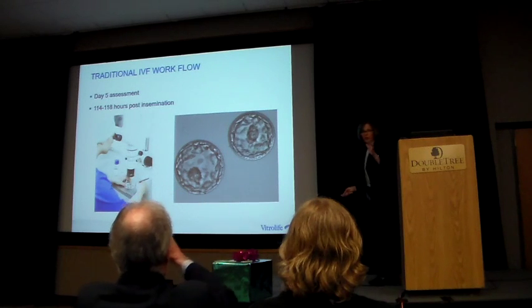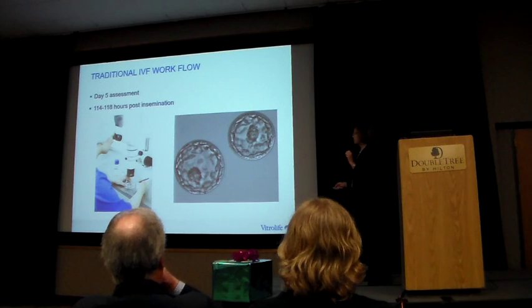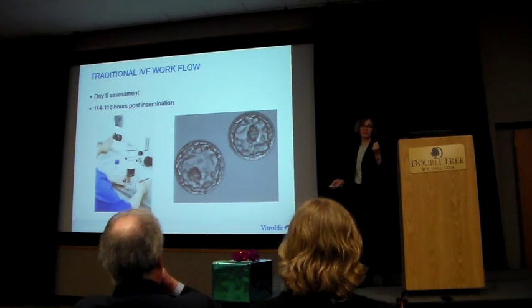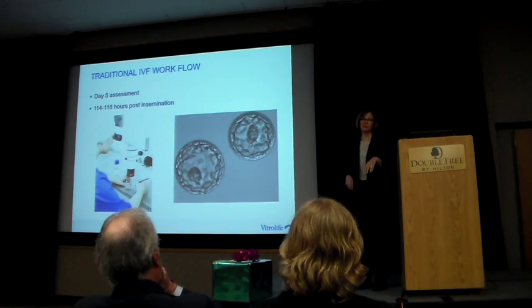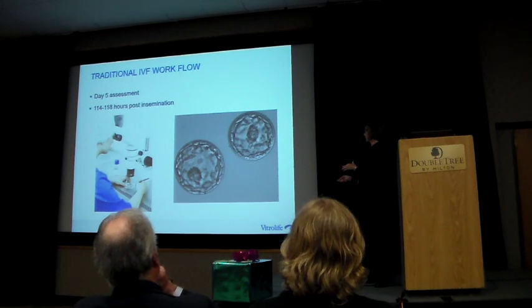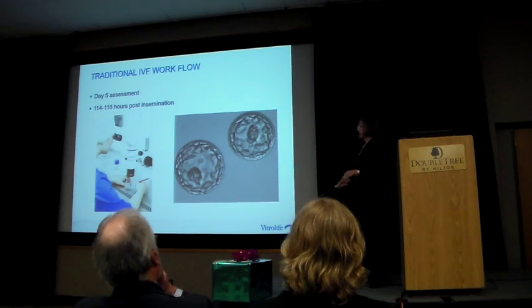It doesn't matter what they are, but the thing you might find interesting is this dark cluster and that dark cluster. That's the group of cells that's going to become the baby. The rest of this whole little bunch of cells around the edge, that's what will become the placenta. So what we would do as an embryologist is we would say, did it make it this far, number 1, because not all embryos can make a blastocyst. And that was a good sign if it made it to this stage.